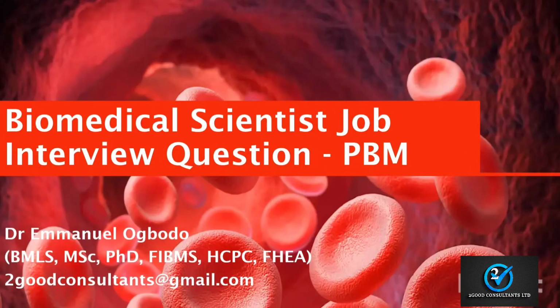So I'm going to be answering some questions which I will try to divide into different videos, okay, of questions that have been sent to me from someone. I think it might benefit us as well. So basically we're going to be looking at someone who went for an interview and they showed the person a blood film morphology, or peripheral blood film, which is PBM. And the person was asked to identify the key features. So we are going to get into that.